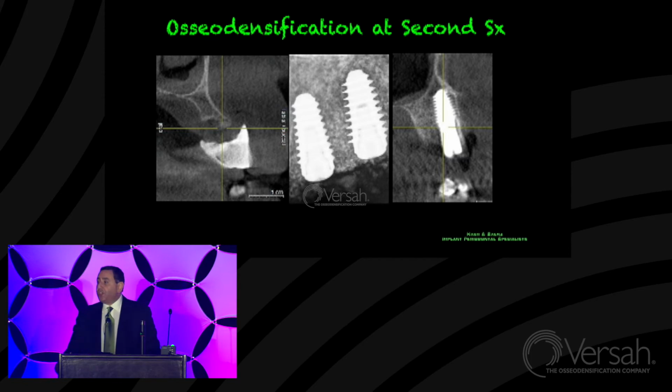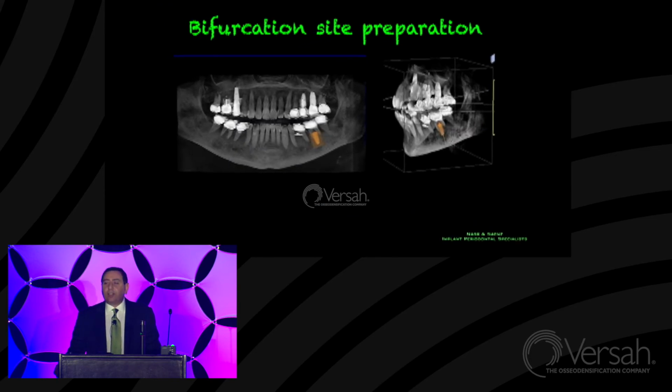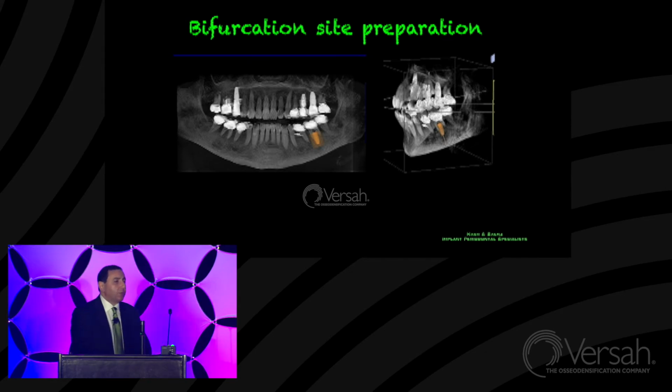Other application that I've seen is I do a lot of immediate implants, and a lot of the patients I see are either maxillary or mandibular first molars, which I find either break a lot after endodontic treatment for several years. Not sure if it's the times, there's stress among patients, they're grinding their teeth, they're clenching their teeth. And I have patients that have some physical disabilities. This particular patient has had cerebral palsy most of her life, and it's very hard for her to clean her teeth. So she had a lot of decay.